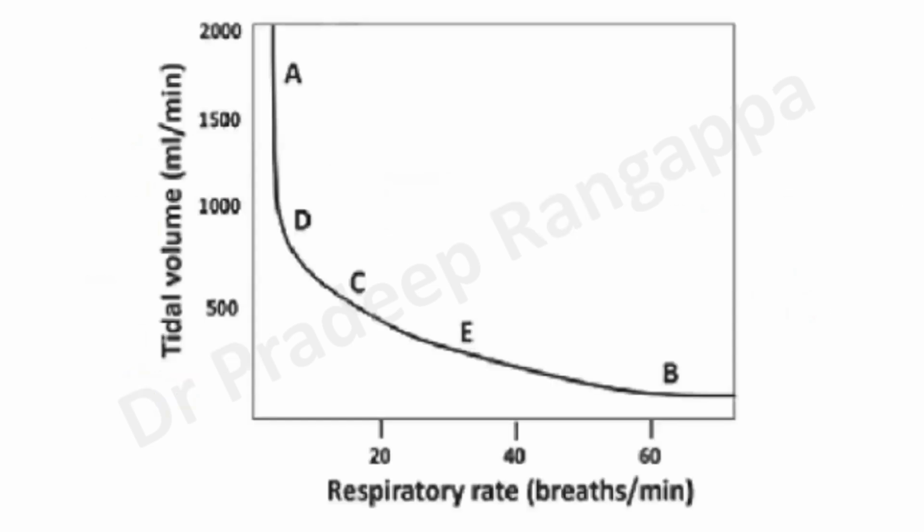Okay, this graph is important. Just pay a little attention to this graph. As you see, the tidal volume is on the y-axis, respiratory rate is on the x-axis. So you set a minute ventilation. Minute ventilation is nothing but tidal volume times respiratory rate. So it needs to match. You have set minute ventilation.